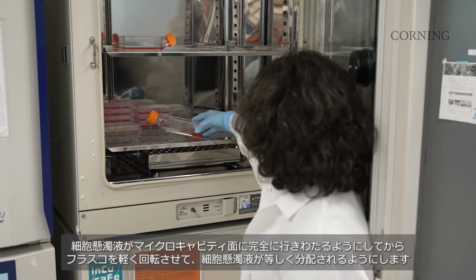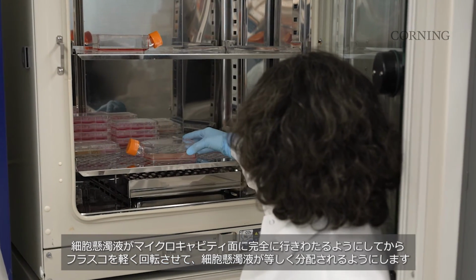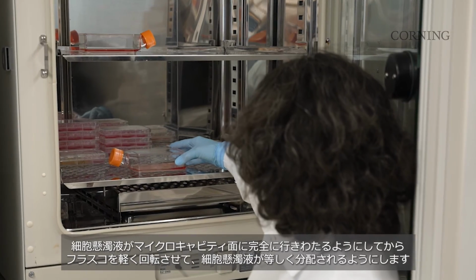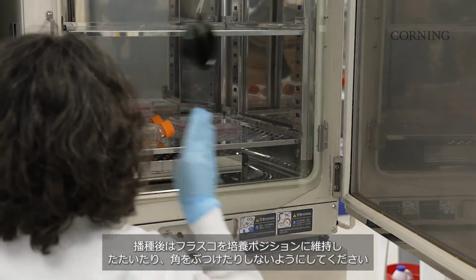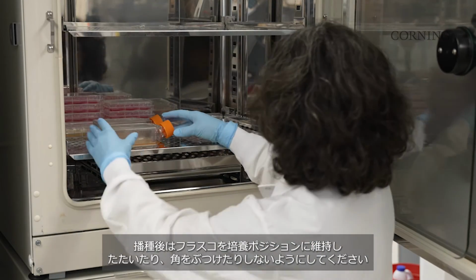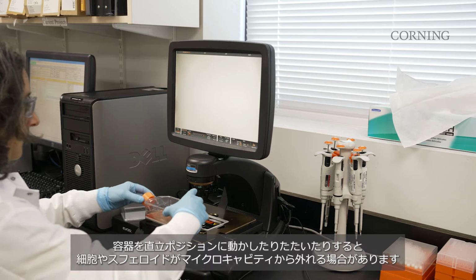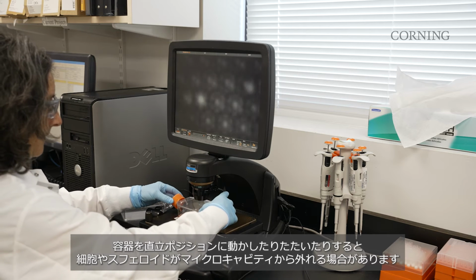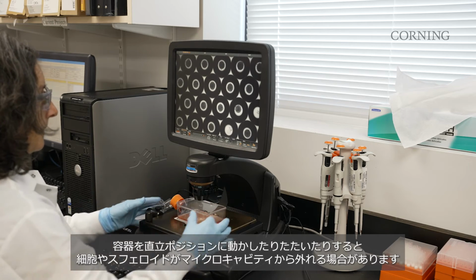As you place the flask in the incubator, gently bring the flask to the incubation position. Allow the liquid to fully distribute across the microcavity surface and swirl the flask lightly to evenly distribute the cell suspension. During normal handling, keep the flask in the incubation position and avoid tapping or hitting the edges of the vessel. Moving the vessel to the upright position or tapping the sides may cause the spheroids to dislodge from the microcavities.